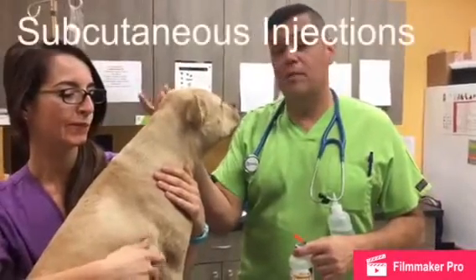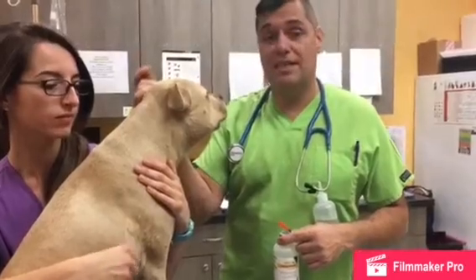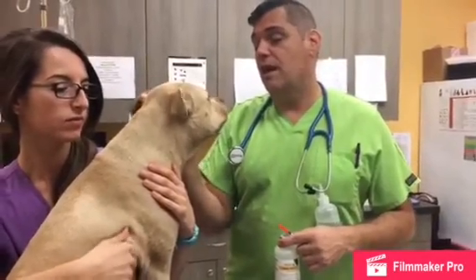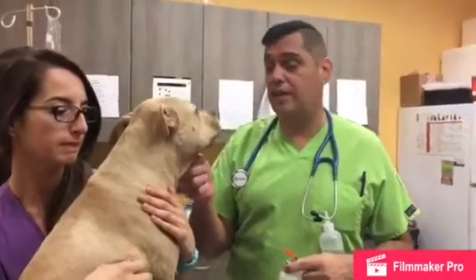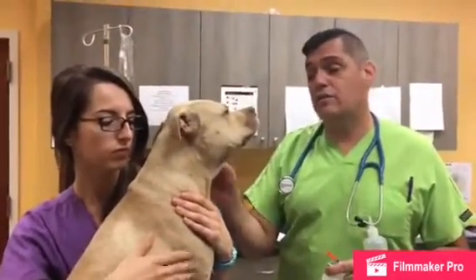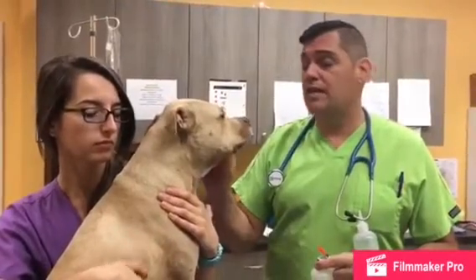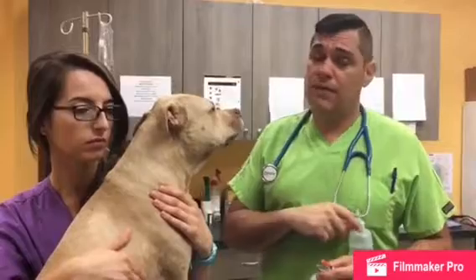Welcome to Meadowlands Veterinary Hospital where we are going to demonstrate how to give subcutaneous injections — sub-q fluids, which many people do at home for animals in kidney failure. This is a great video to learn how to do that, and diabetic pets also need regular daily shots at home, so this video could be helpful to you.